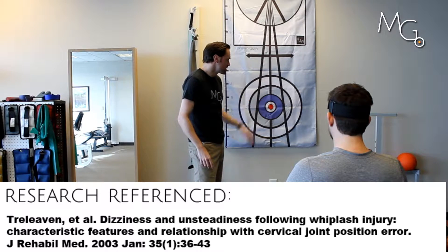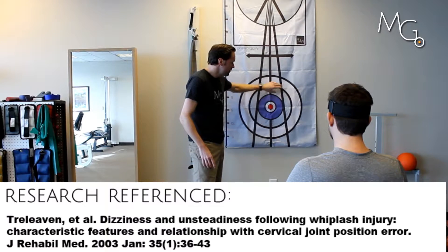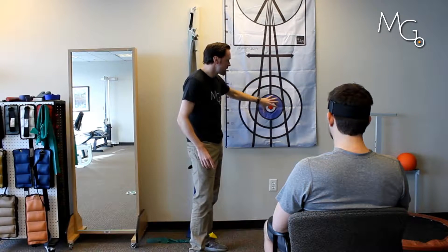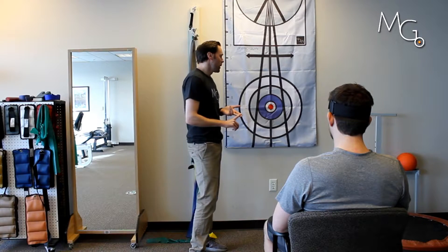As you're doing these movements, if Chris is unable to return to this blue circle — if he's outside of that — that would be outside of the standard deviation. That could be considered an error or just poor proprioceptive skills. And of course, you want to test that in repetition.